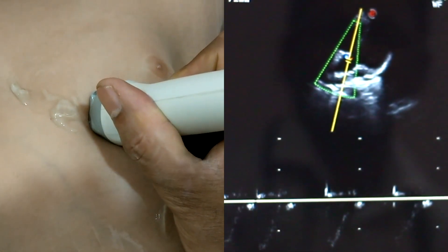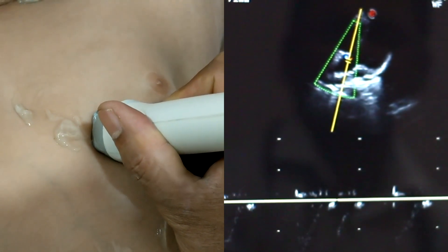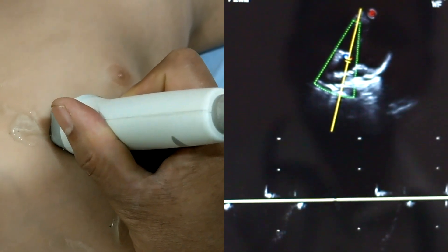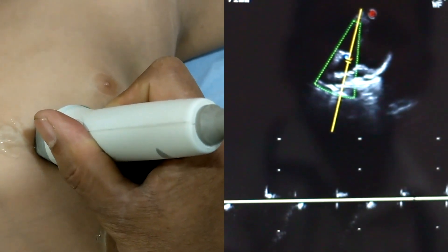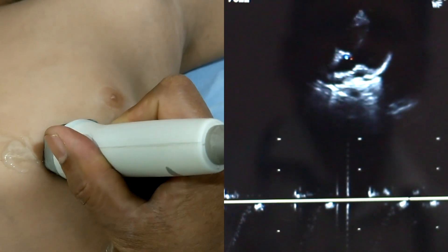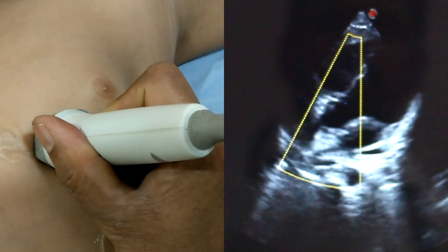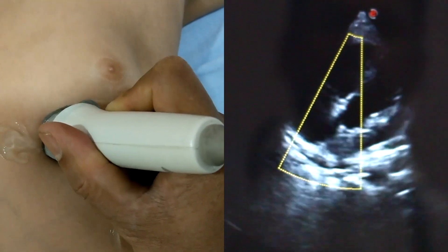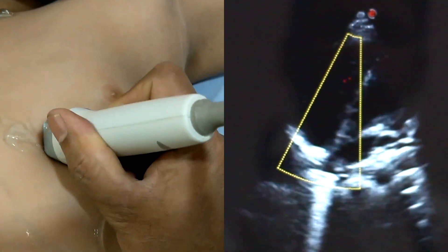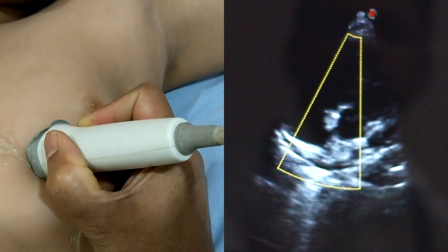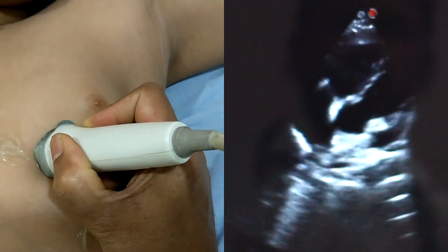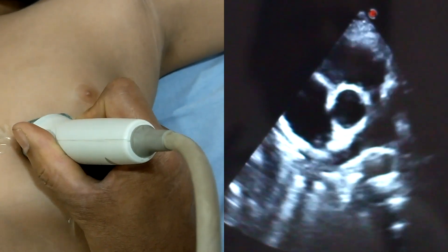This is the aortic flow by pulse wave Doppler — a way to assess aortic flow velocity. By pulse wave Doppler or continuous wave Doppler, we can assess the velocity. In this case, there is no ventricular septal defect and no cross color flow across the septum.